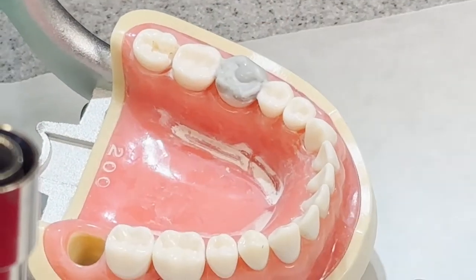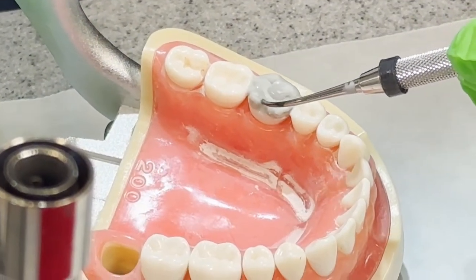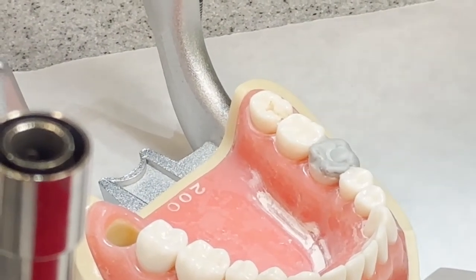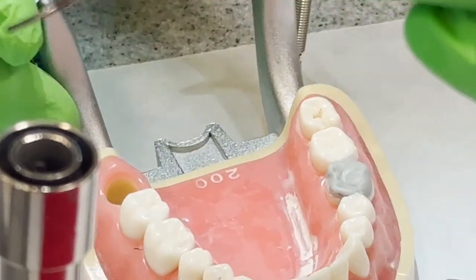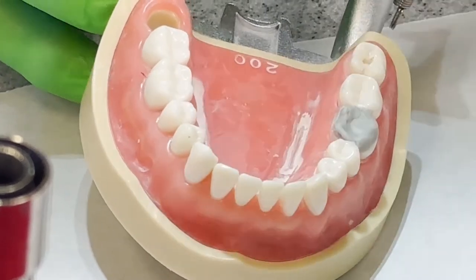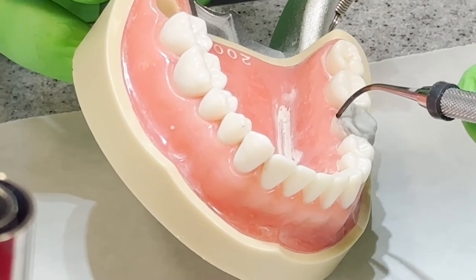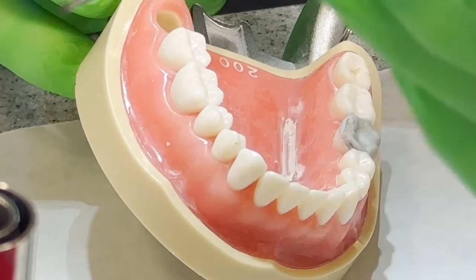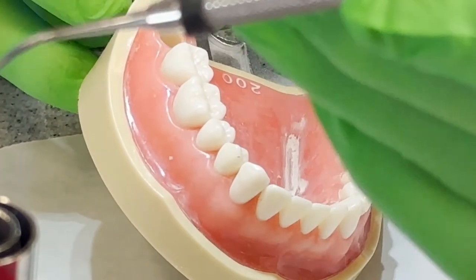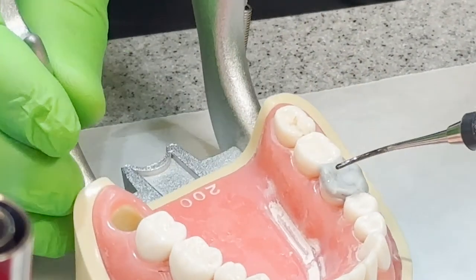Again, if you want, you can just put a bunch of wax in there and carve back. I like this technique a little bit better because it helps me locate where my cusps and everything should be. If I'm going to err, I'm going to err on too much wax, I can always carve it back. But your margin should have all of the wax on there, okay?